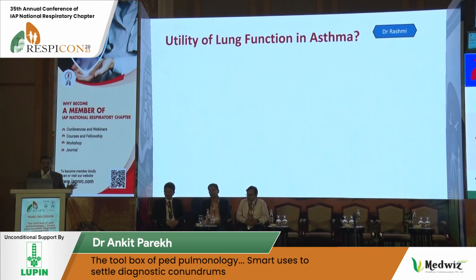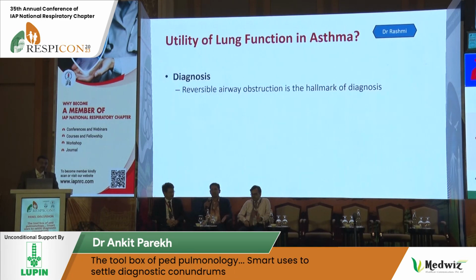So Dr. Rashmi, time and again we are emphasizing that lung function should be done. Again I'll come back to the basic question: can you summarize why you think a lung function should be done in asthma? This is very important because not all that wheezes is asthma. You may get some bronchodilator response and it may not be asthma; it may be something else. So it is very important you do spirometry to document the reversibility. Airway reversibility documentation is essential for the diagnosis of asthma.